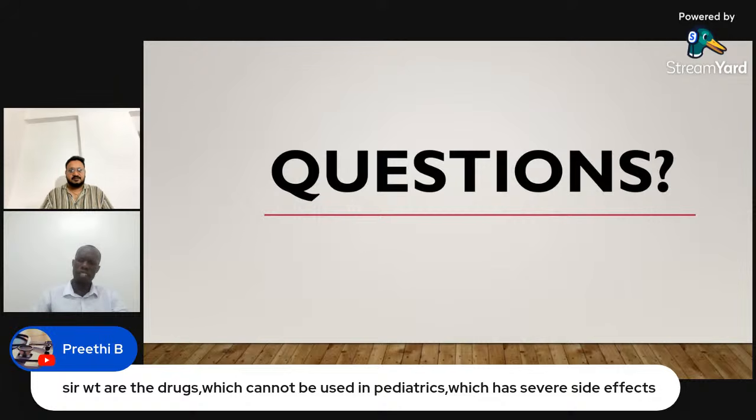Even priming with it. Remember, in the slide they talk about hyperchloremic acidosis. That's why you don't even prime the circuit with normal saline. Now, what if you do?